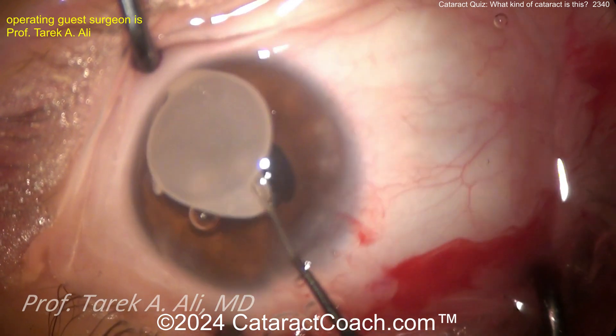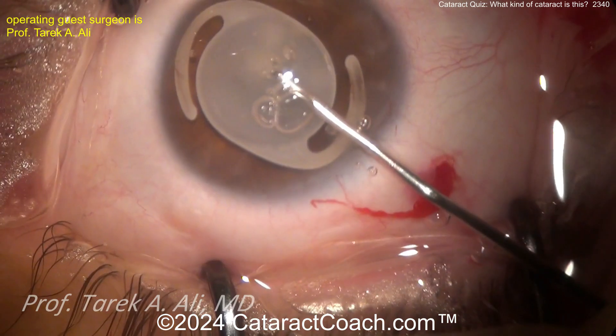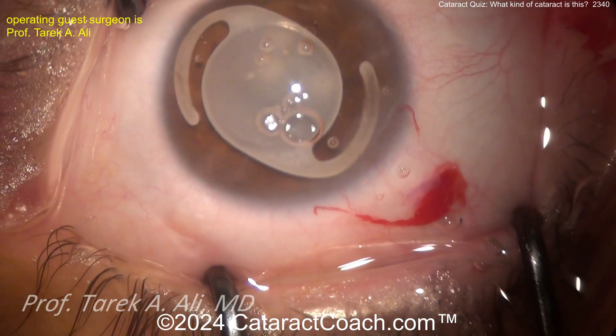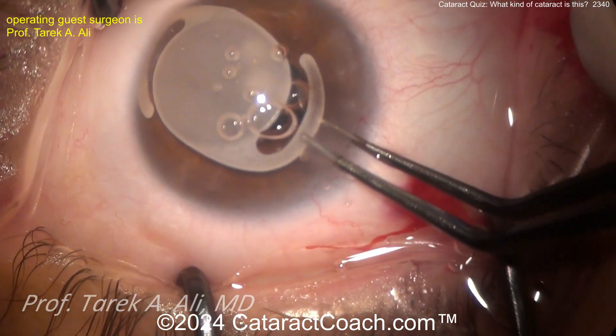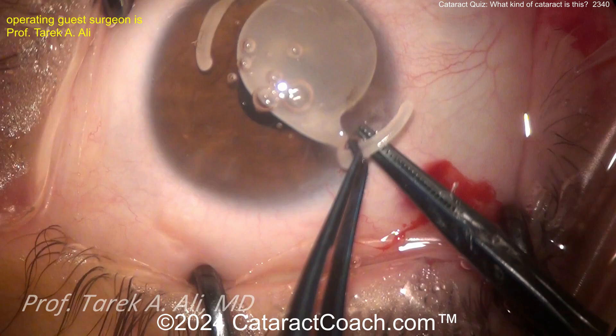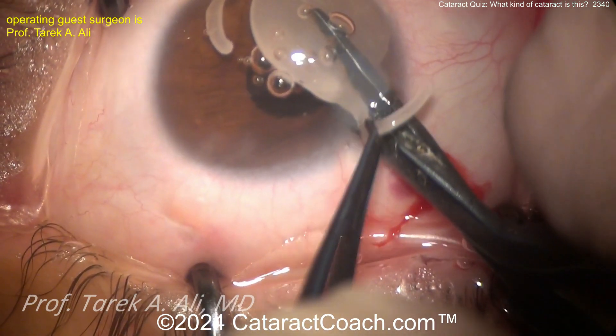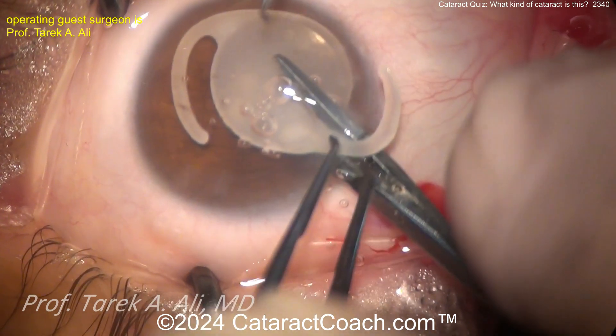Once the haptics are separated, I like to bring the optic up too — so I do haptics first. There it is, there's the whole IOL. More viscoelastic is always a good thing to protect the cornea. Now, bringing one haptic outside the eye — there are the iridectomy cutting scissors — so cutting that. Be careful not to let the lens touch the cornea.